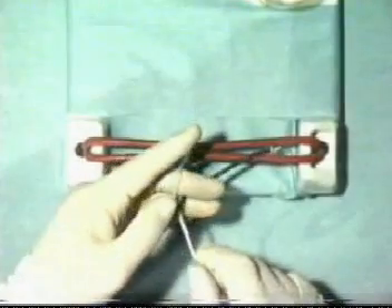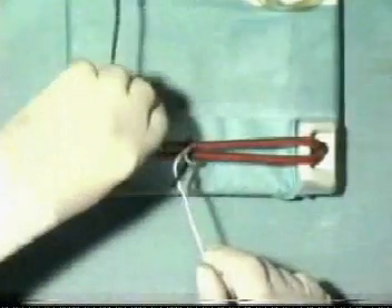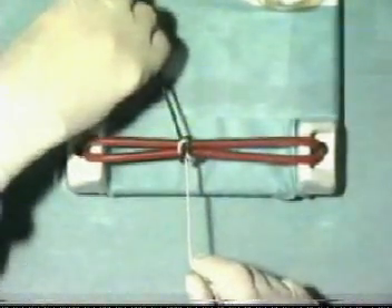Here is the middle finger knot being tied, and this time the black end of the suture is taken away from you as you tie it down.